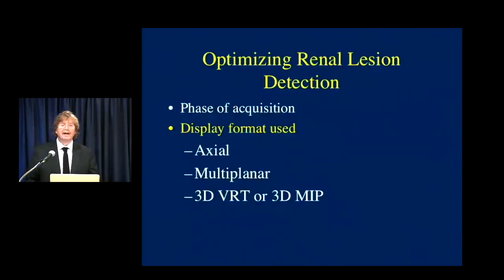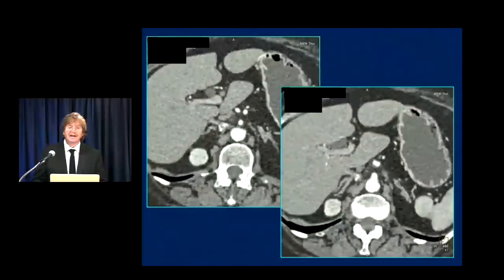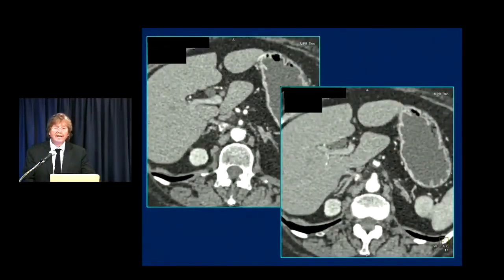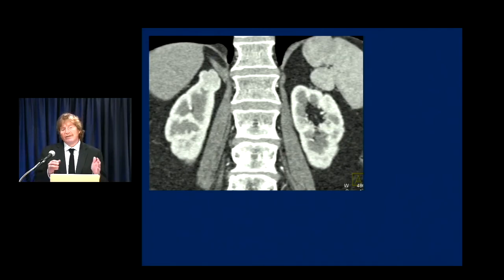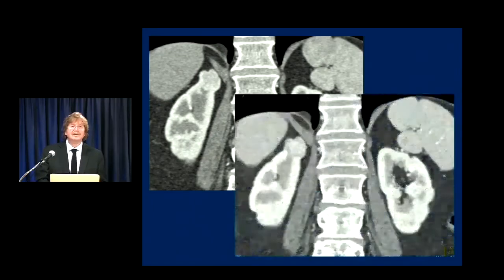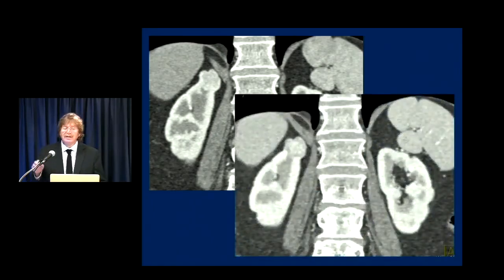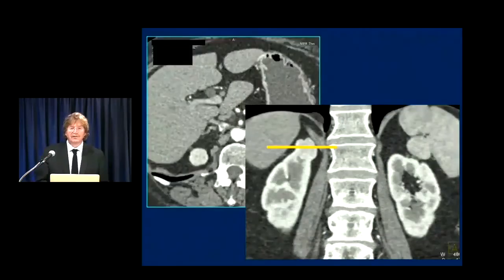If you only look at axials, it's easy to miss things. A classic example: a scan was read as negative. The upper pole of the right kidney looks unremarkable on axial imaging, seeming to blend with the rest of the kidney. But on a coronal view, it's obvious — a classic renal cell carcinoma visible from across the room. At a minimum, you need to look at coronals and sagittals, particularly coronals, or you're going to miss lesions.